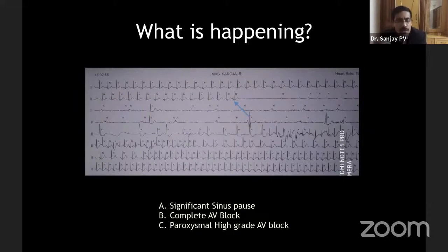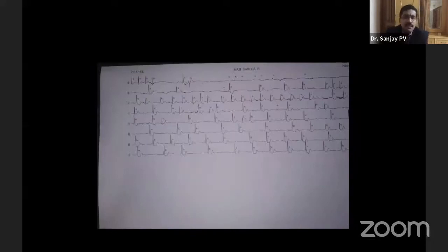As Javed Boss told, this is the most dangerous of AV block. The patient will collapse within hours if you don't attend to them. Whereas in a patient who has an AV block with a stable escape rhythm, it's okay. You need not put in a temporary pacemaker. But this patient, we put in a temporary pacemaker and we took her up for permanent pacing. The interesting thing is, this is another Holter which shows multiple episodes. She had some episodes preceded by the PAC, some by a PVC.